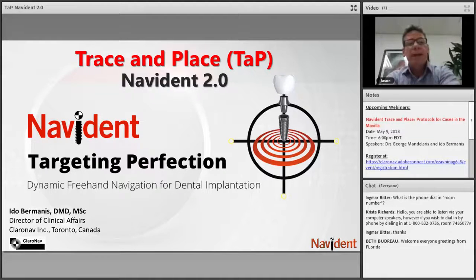So we have a global audience here this evening, or for some of you, I guess, this morning or this afternoon. Many of you are current users, and many are hopefully future users of Navident after this evening. So the paradigm shift alluded to in the title refers to the registration of the patient CT data to the actual patient prior to navigation.